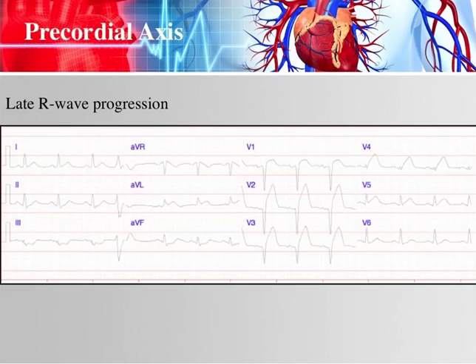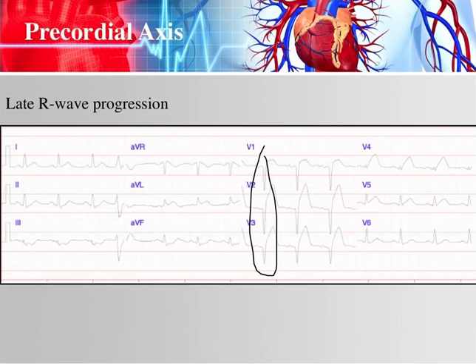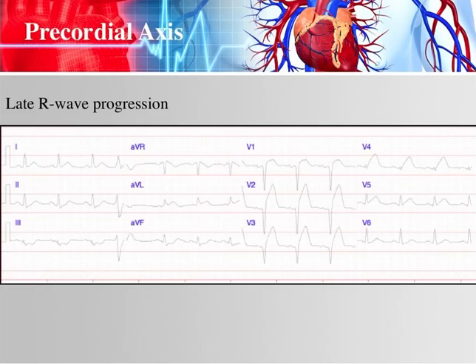Here's an example of late R wave progression from an anterior wall infarct. It's pretty obvious — there's major ST elevation, and you have essentially QS waves in the right precordial leads. V4 may be equiphasic and rather small, but it should be mostly positive. This is the axis rotating to the left, giving us late R wave progression, which is very common with anterior wall infarcts.